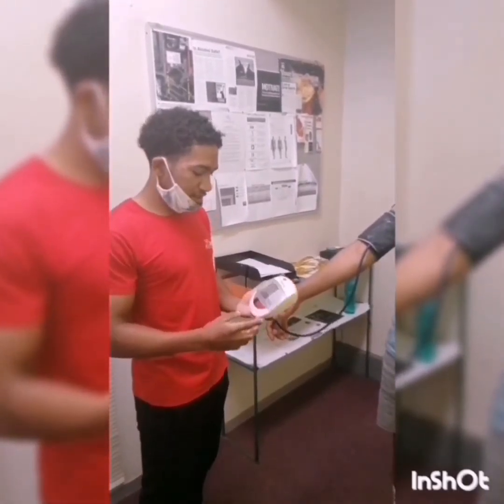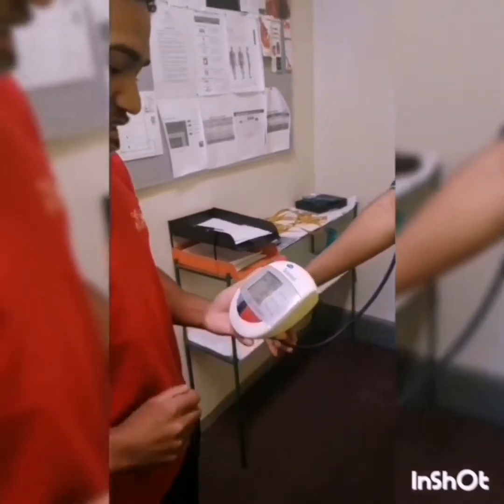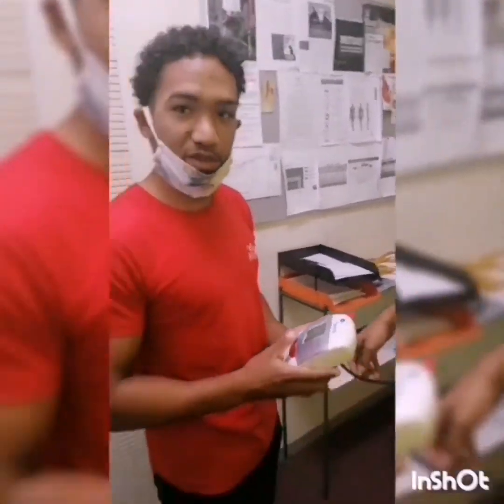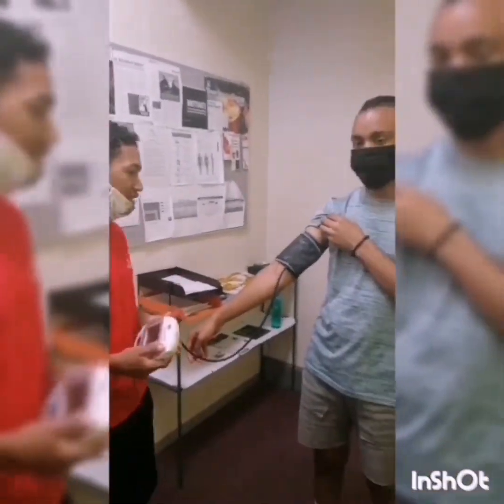So as you can see, his systolic reading is 127, which is normal, and his diastolic reading is 84, which is also normal. So next we're going to assess client's resting heart rate.